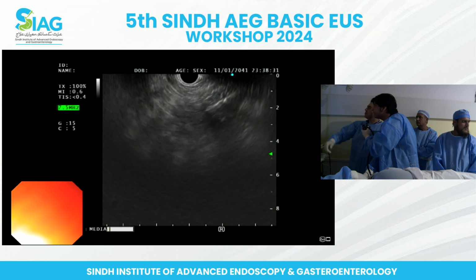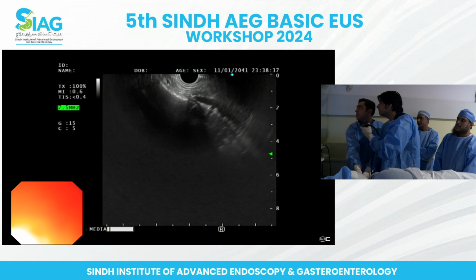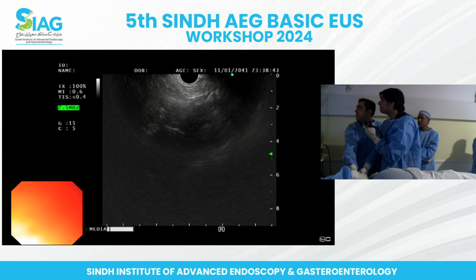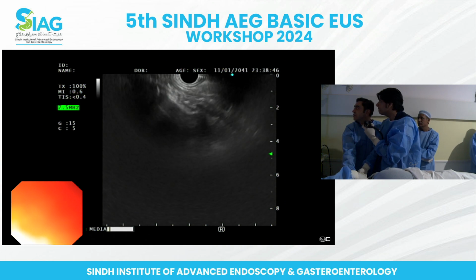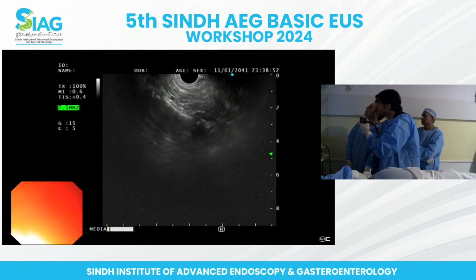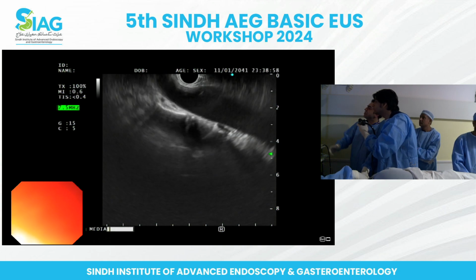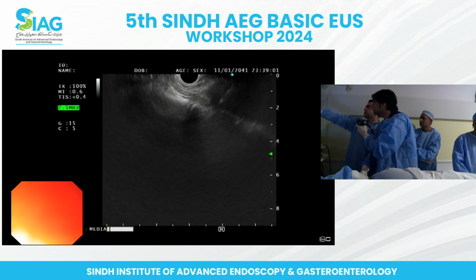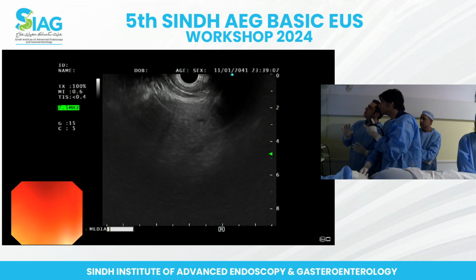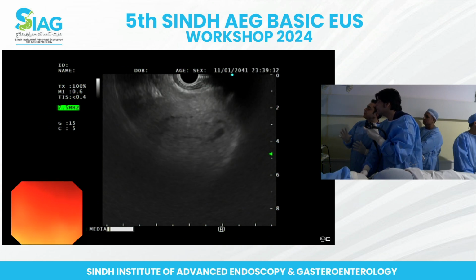So I think you just slipped beyond it. Just there, yeah, that's it. But it's quite horizontal, isn't it? So push the scope in slightly there at this level. So turn it around, clockwise torque. So it's very stiff, isn't it? Now that's it. That's the aorta, but you're quite high up, so you just need to push the scope down, and I think you're pushing on it with the wheel. See if you can move the big wheel away from it, and that's why you're not getting a good image. So keep the wheels in the neutral position.